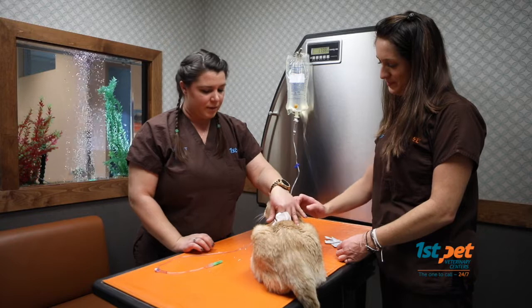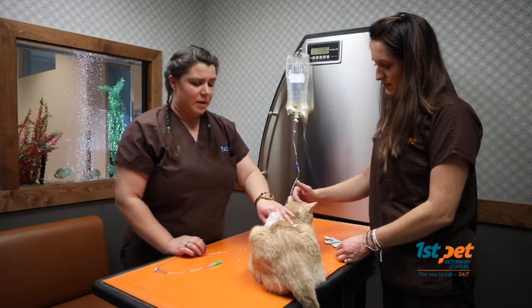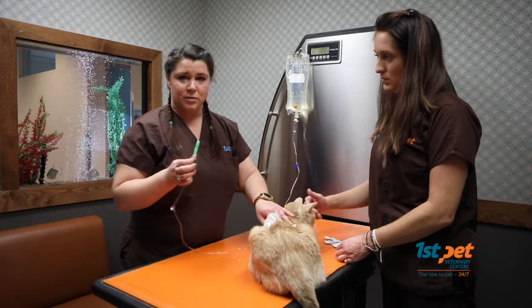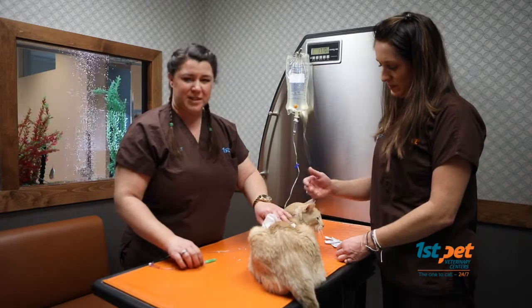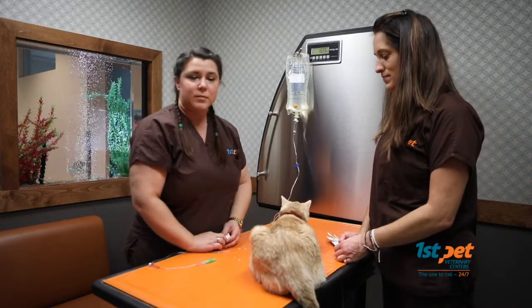We'll just hold pressure here for a minute or so. If you do see that there's some leaking coming out, that's okay. We did use a large bore needle. We did make a big hole. It's simply okay that fluid leaks out.